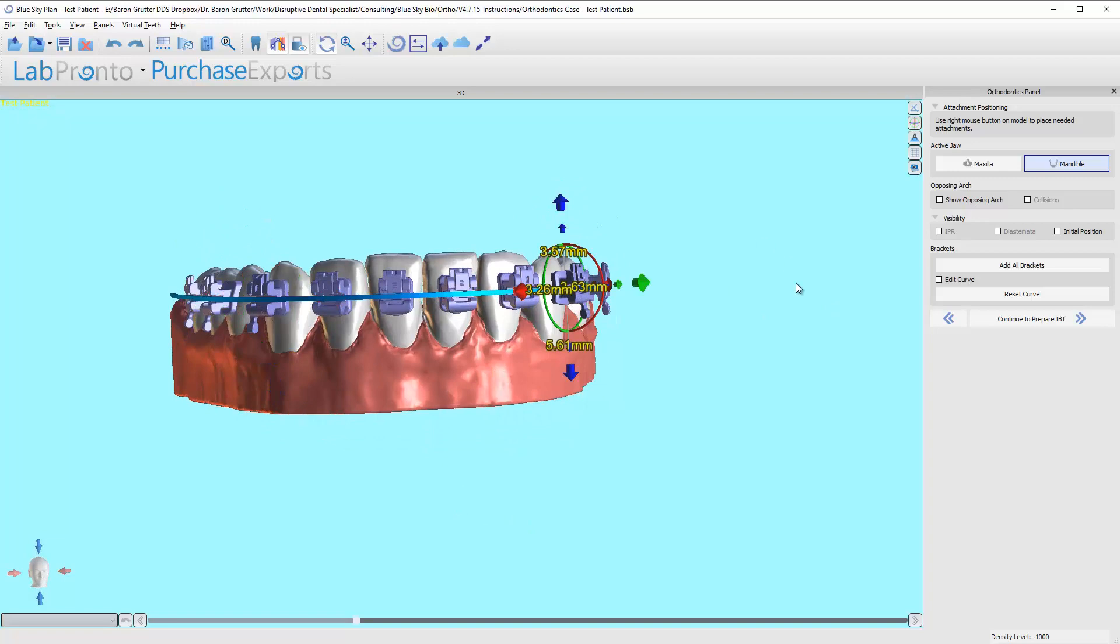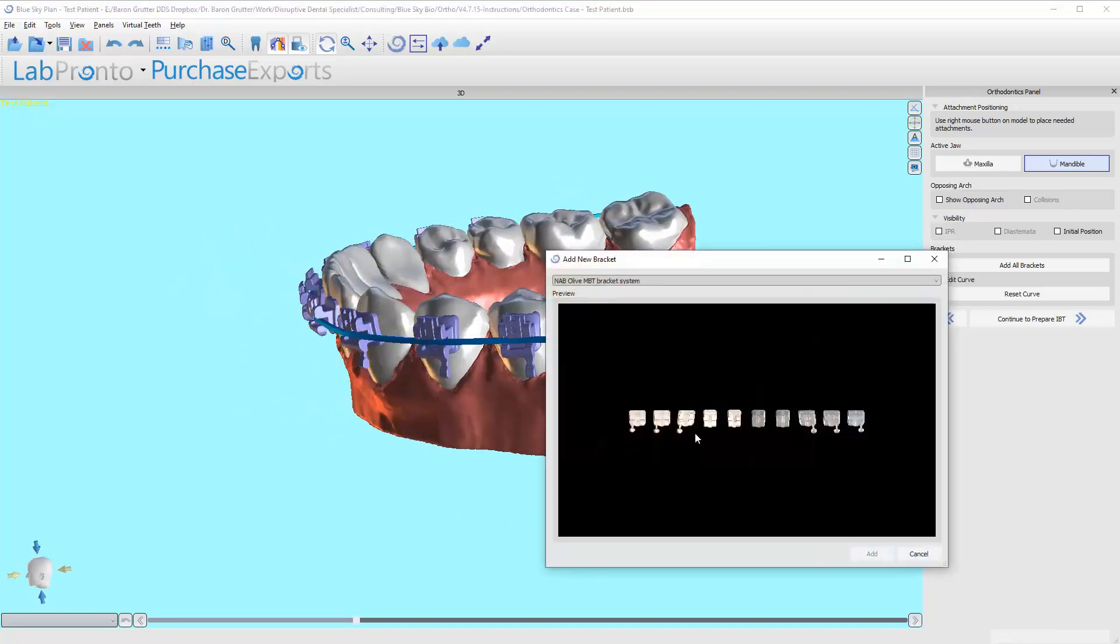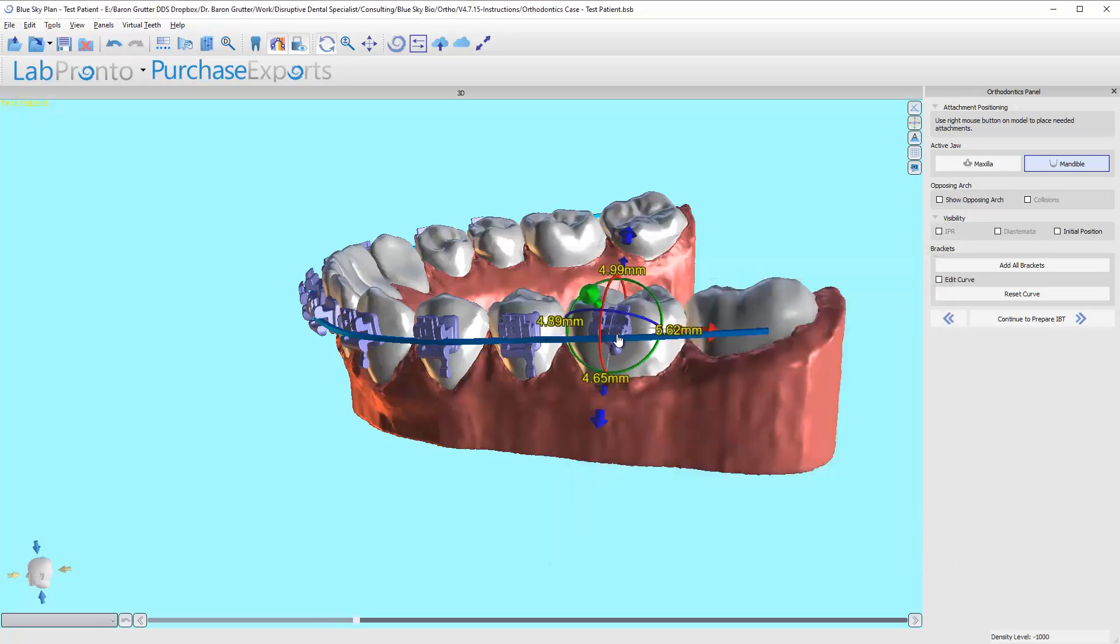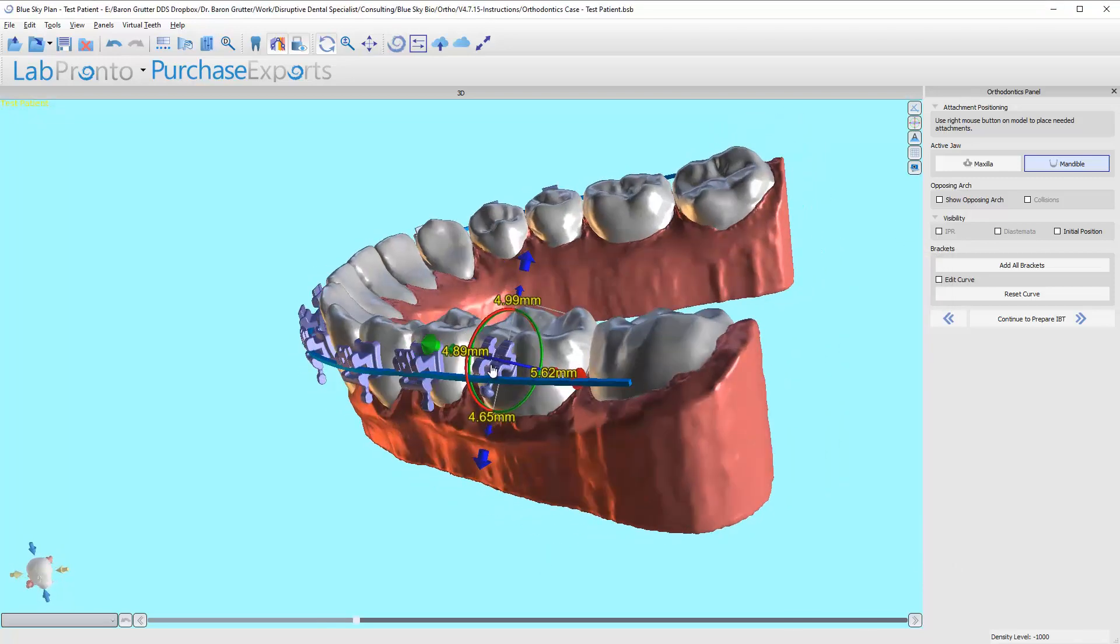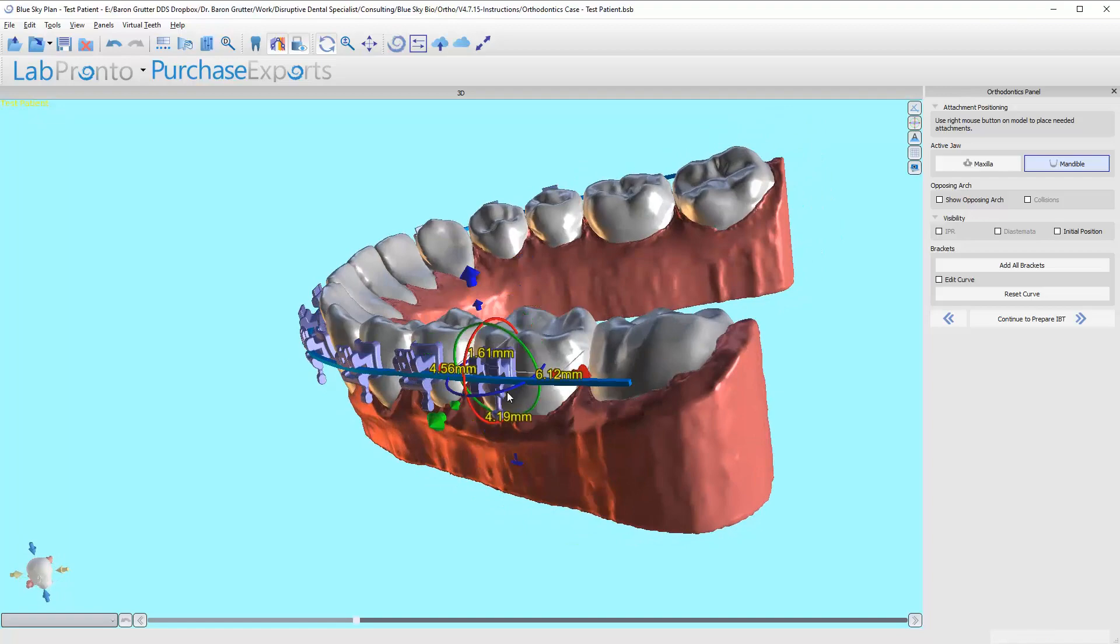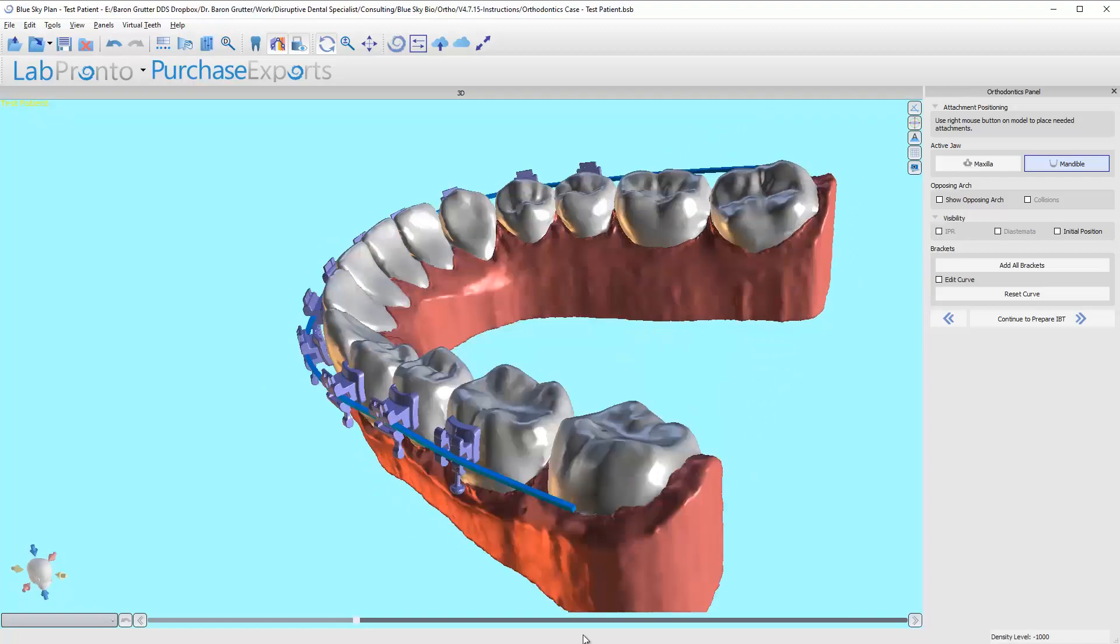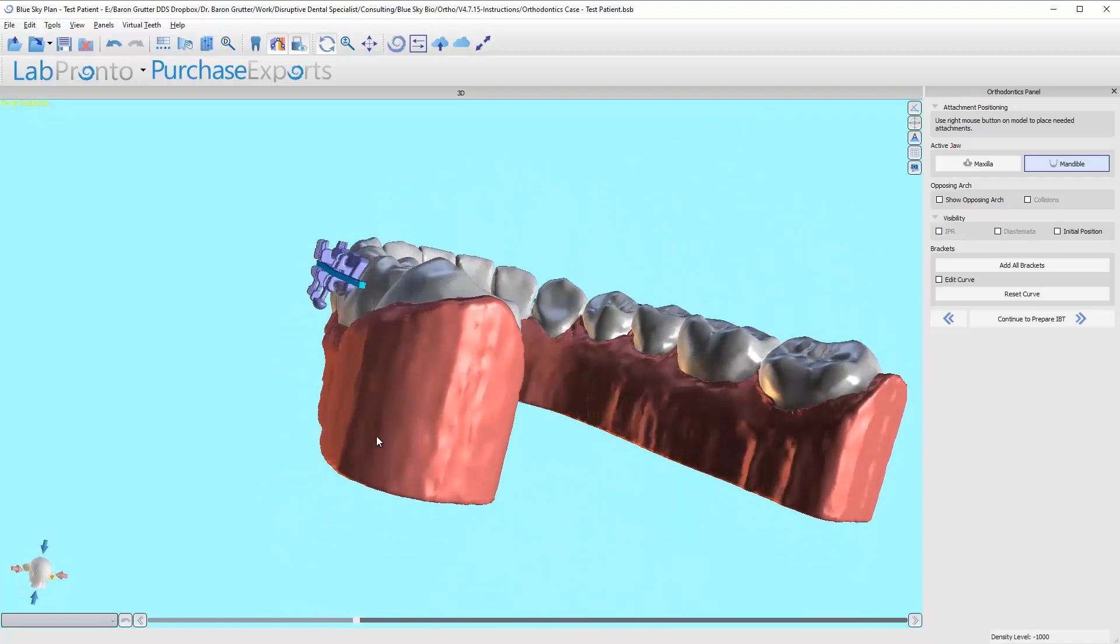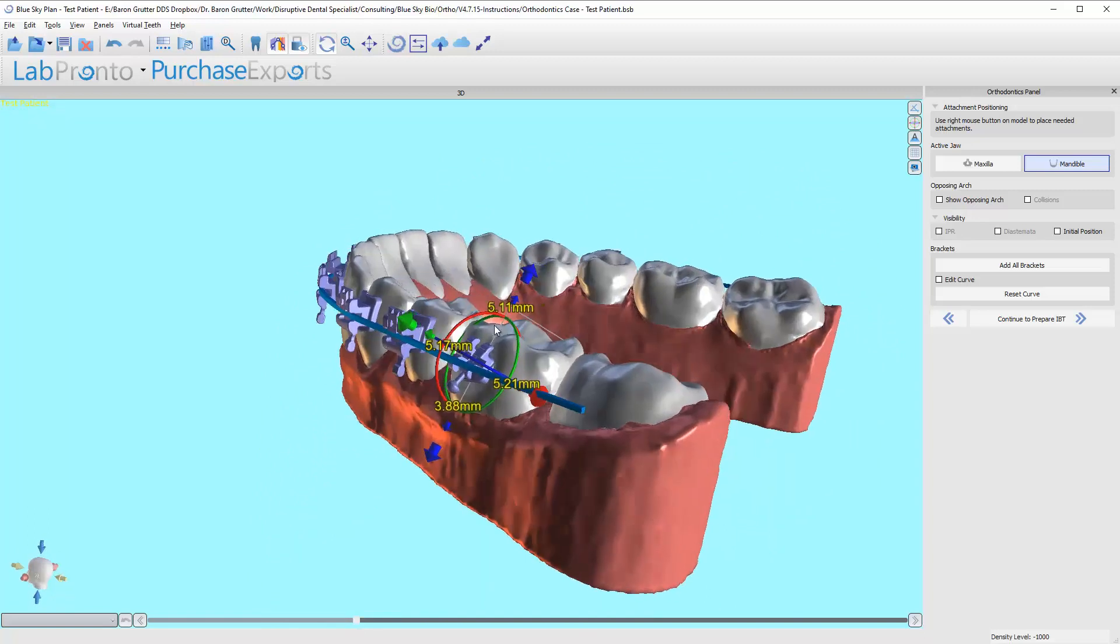You can also go through and I'm not going to remove them, but you can add a bracket manually. Again, I don't need this bracket, but there's different ways to snap it to the wire. It lines right up to the wire.